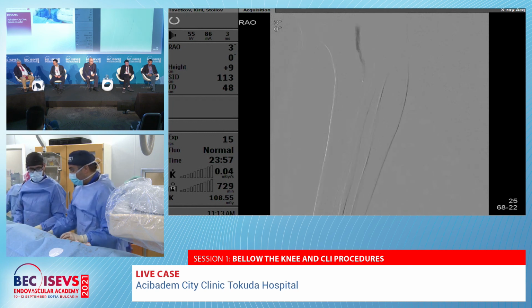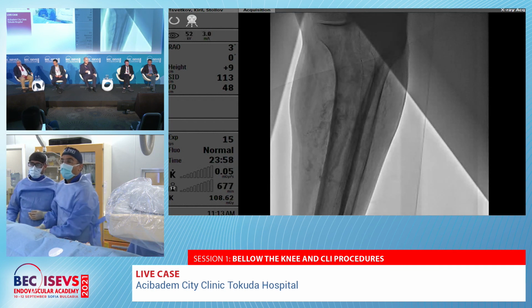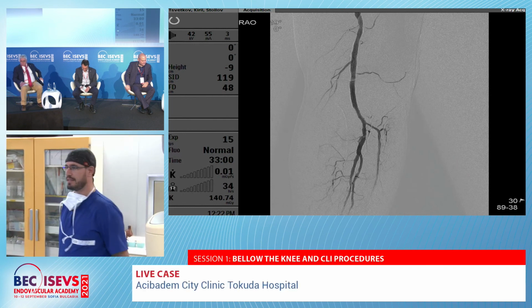Give me this one, just a moment. Okay. You want to try without Bernstein? I will try. Continue with the presentation. It's straight, wow, it would be very difficult. As a matter of fact, we are ready and I'm waiting to show you the final results.